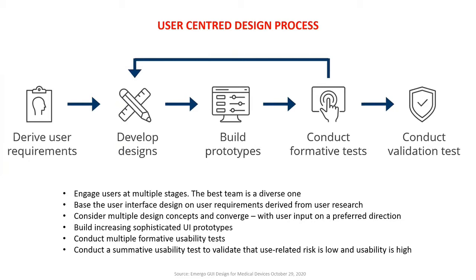It's a process which allows interaction, questioning, and observation in the early stages, and as you move along this line, the prototypes are getting more sophisticated. These days, in the following slides, I'll show you some of the process, but you usually end up with clickable prototypes on a device that can be put with actual users in the environment to do some of this testing and refine it.